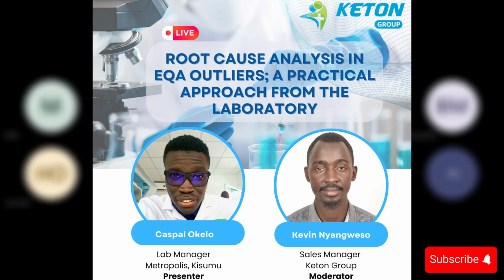Then another thing that you'll be using to monitor is the subsequent EQA performance, your next EQA cycle results. Was the bias reduced? Was there an improvement in your Z-score? There's no recurrence of failure. So EQA, as we know, is the strongest external confirmation that something was corrected.